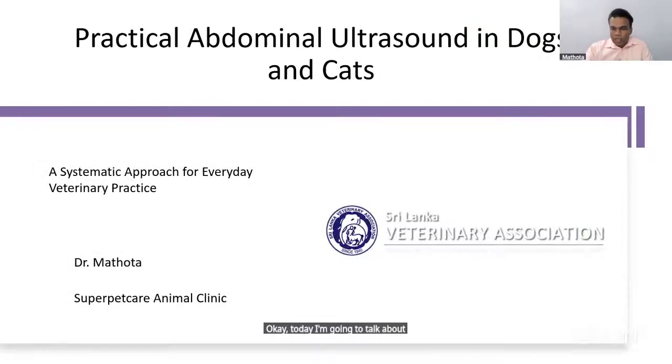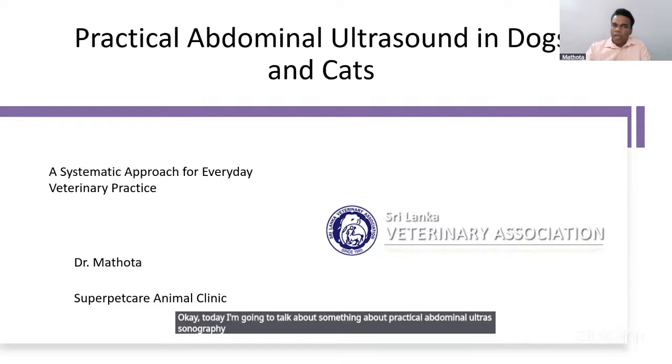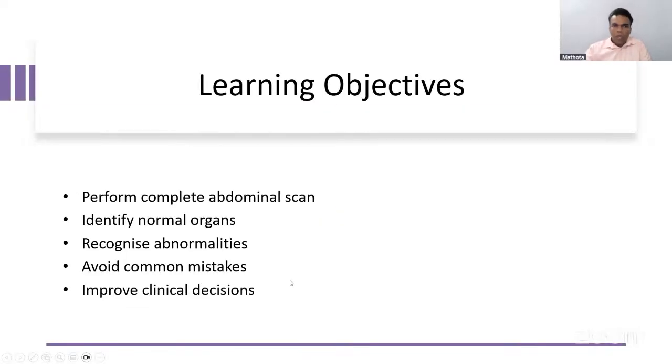Okay, today I'm going to talk about practical abdominal ultrasonography. Practically, what we can do with an ultrasound machine. This is my objective today.